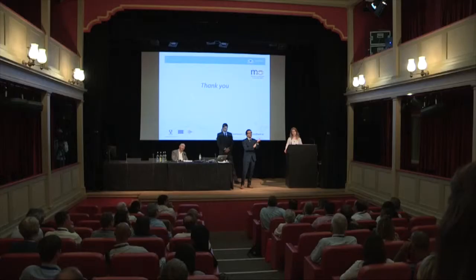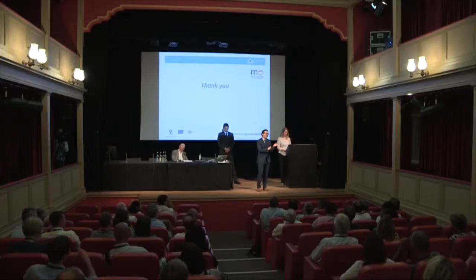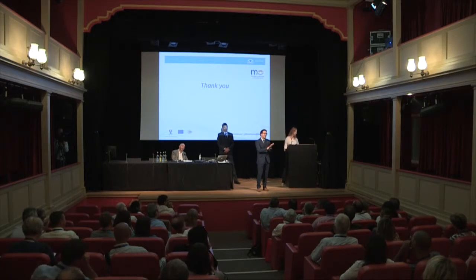I think the reason you asked the question is I've seen what's happened in the UK with all these devices, and a lot of them don't work, and there's been a lot of frustration, and I understand why. One generic conclusion we can make, and I think Jessica alluded to it, is that if you're interested in measuring someone over time, don't interchange.